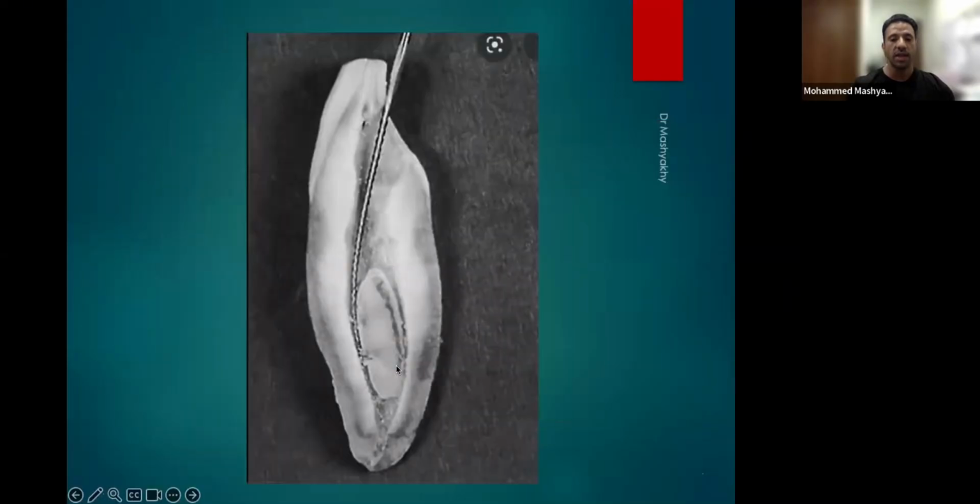So whenever you have this kind of canal, the problem is if you have an access cavity from the lingual side and you put the file, you always get the buccal canal, and you finish it up and you think you did a good job, but there is some missing canal. So if you have some experience, or from today forward, listen to me.